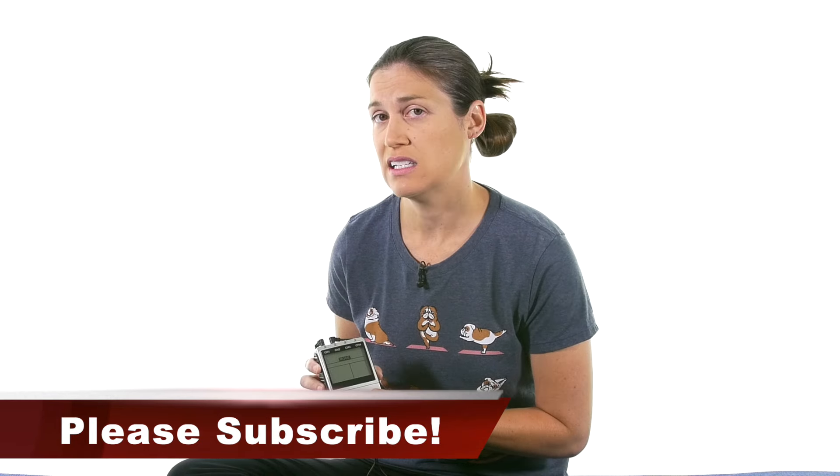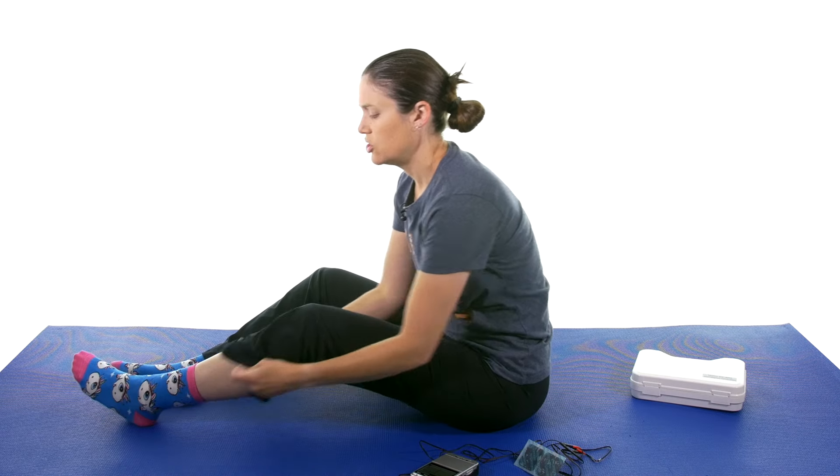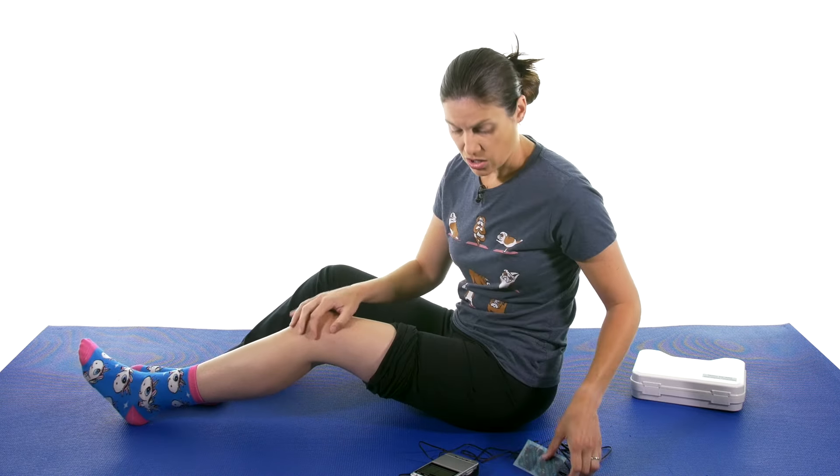It also has an intensity that goes from zero to 99, which makes it really powerful going up to get that strong current if that's what you need. But you can also have the lower and the high. So I'm just going to show you a couple of different things on my knee here.